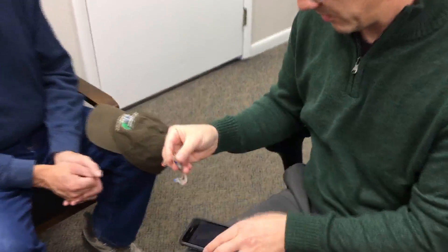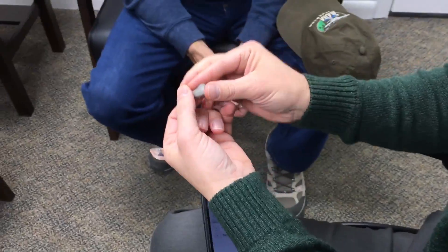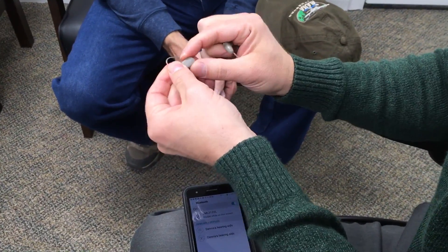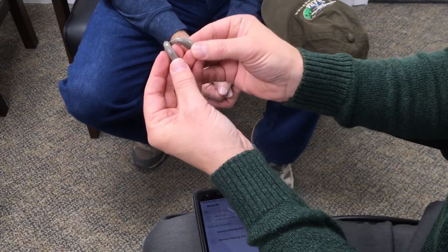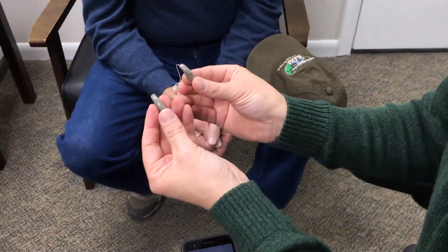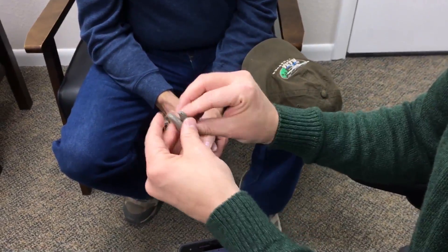We're going to restart his hearing aids. He's got a battery-powered device, so this is easy — just open the battery door, close it, open and close the other one. If you've got rechargeable ones, you push and hold the bottom button, give it about a five count and they'll power off, let go, then push and hold again for about a five count and they'll start up.